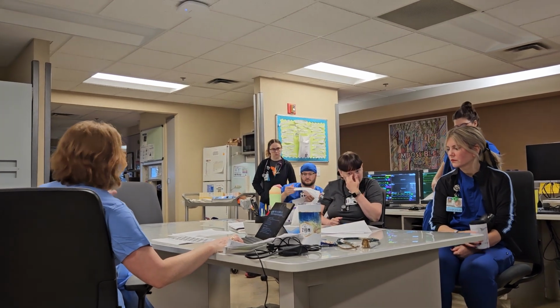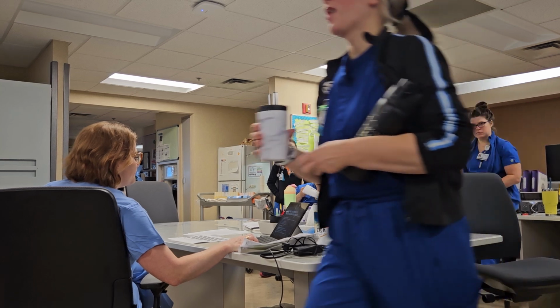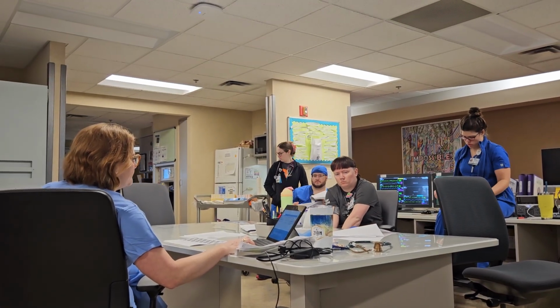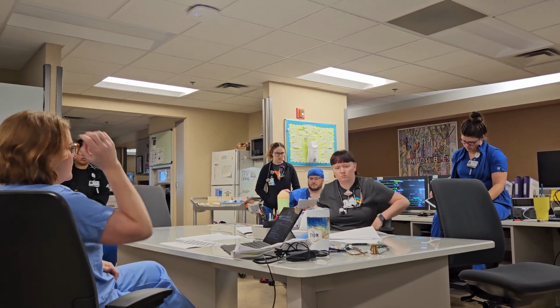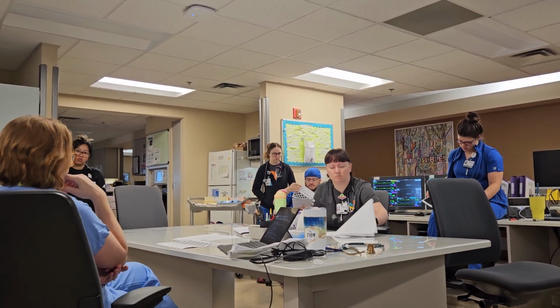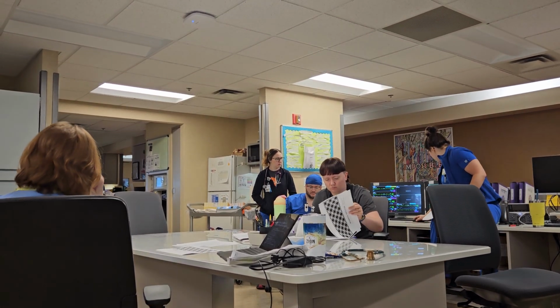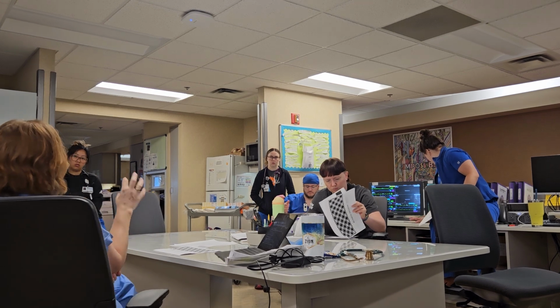First of all, any questions or anything that anybody wants me to clarify or go over? I do want to go back a little bit to this slide on volume control. For tidal volume, the older school of thought used to be about 10 mLs per kg of ideal body weight for target tidal volume.